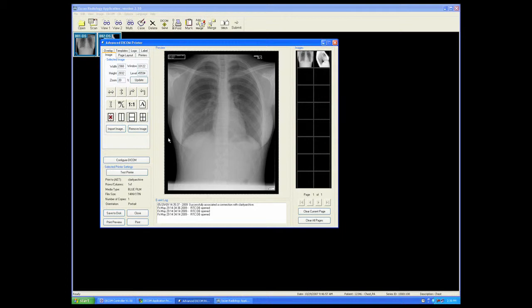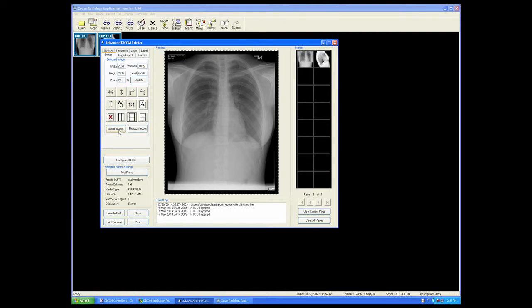We also have other features in here, such as removing the image, importing images from other locations, and exporting this image to a disk.